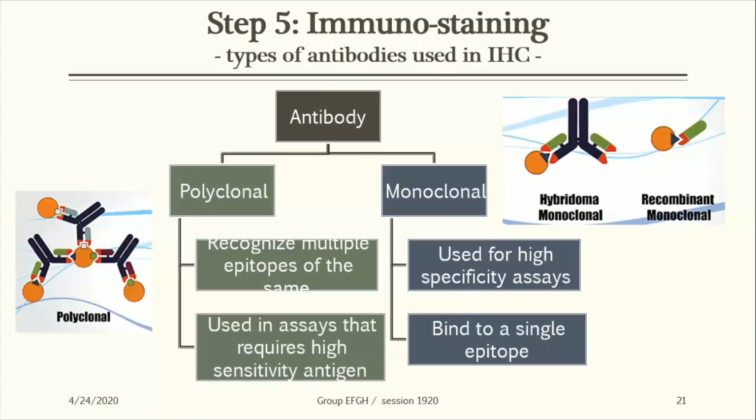So monoclonal will provide a highly specific assay, whereas polyclonal will be used in assays that require high sensitivity for the antigen.